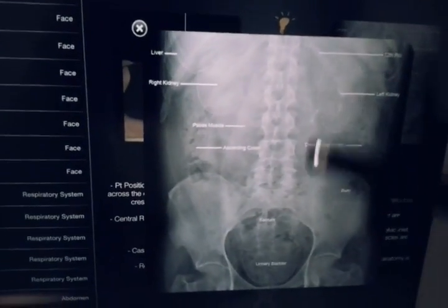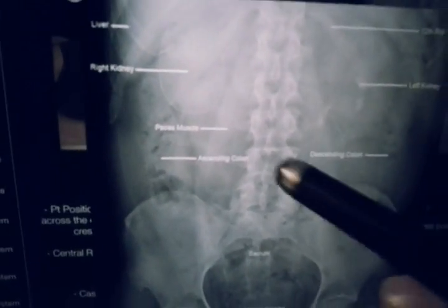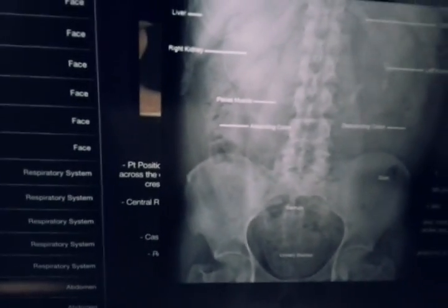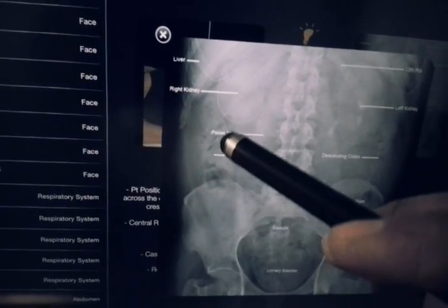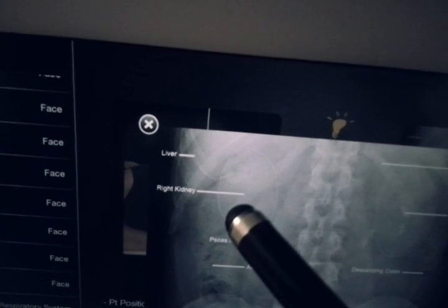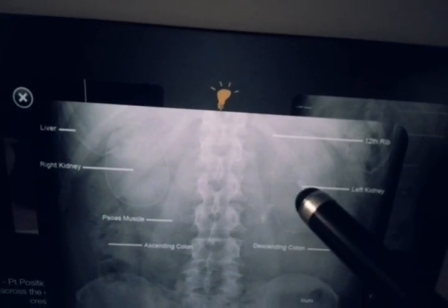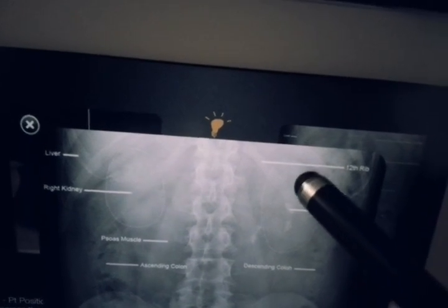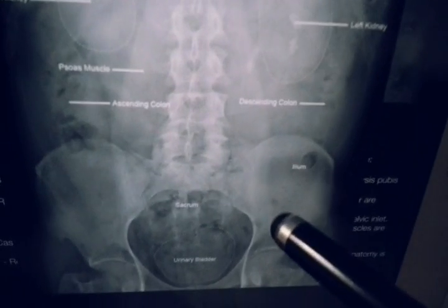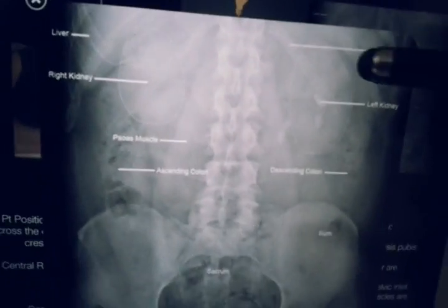Now coming to X-ray interpretation — here we can appreciate the ascending colon starting from the cecum at the ileocecal junction, ascending upward to the hepatic flexure. We can see the right kidney shadow posteriorly near the 12th rib, and the liver shadow. The transverse colon and the left kidney shadow are visible, with the left kidney in relation to the 11th and 12th ribs. The descending colon, sacrum, and urinary bladder area can also be identified.